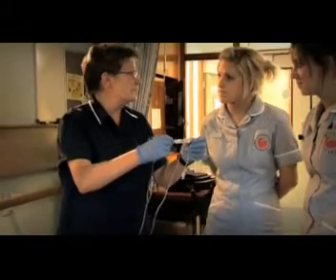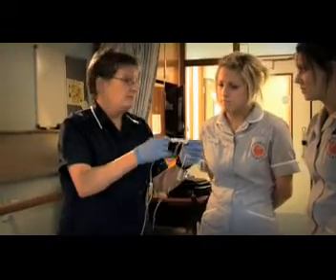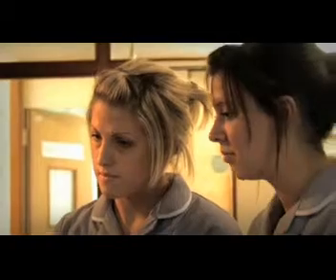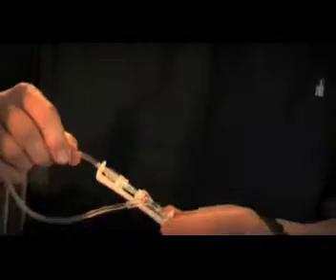Once correctly in place, the IV Sty prevents the two lines from becoming disconnected, even if the IV set is moved, as will happen a lot in normal use.